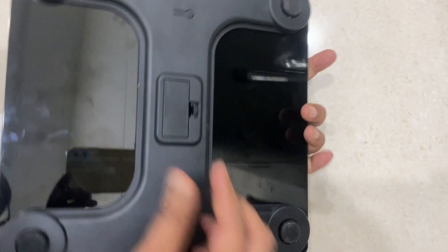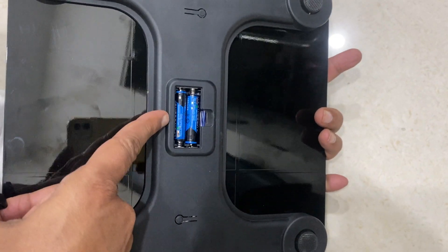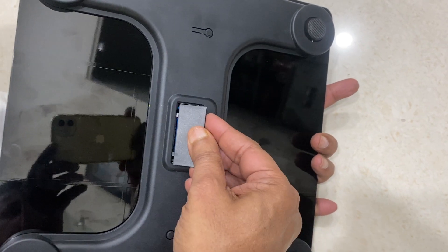On the back side there are cells. You put two cells — double A or triple A cells — two numbers are put.